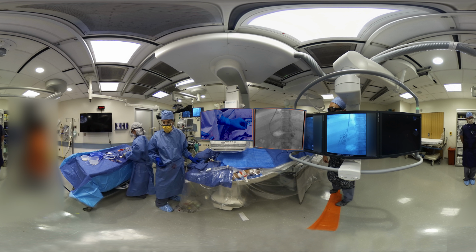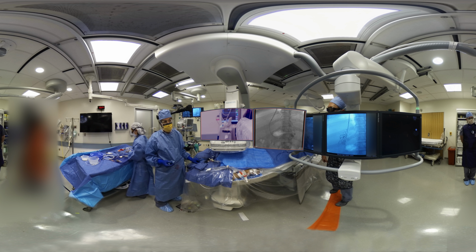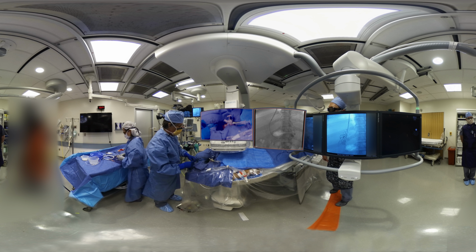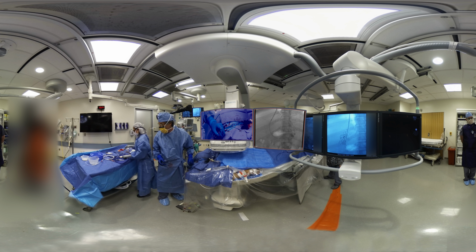Remember, the atrial pressure is relatively high to begin with, but that gradient is substantial, and there was a clue to that, not only from the big spleen, but from the sluggish flow. So we're going to put on our speed shoes to get some decompression in. So let's have the 180 Amplatz guide wire.